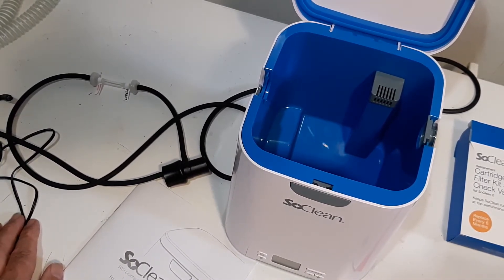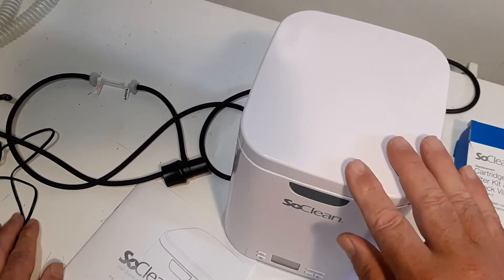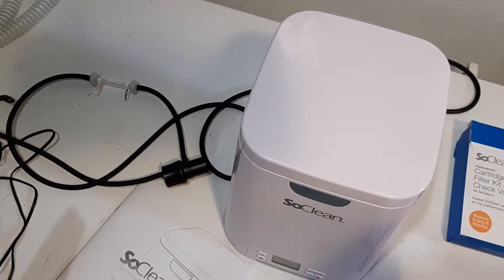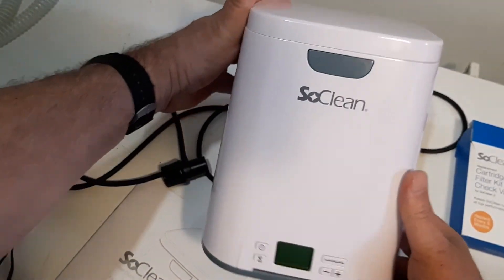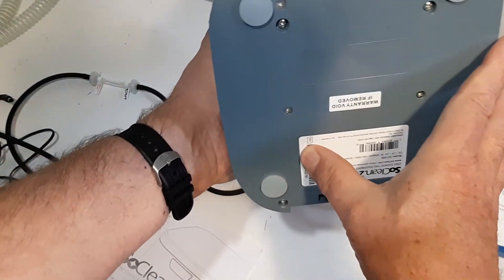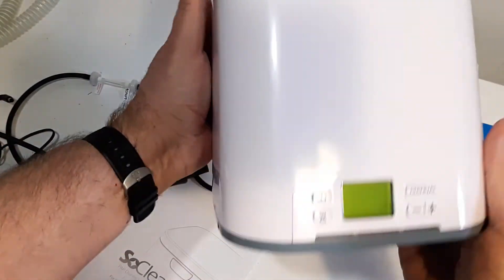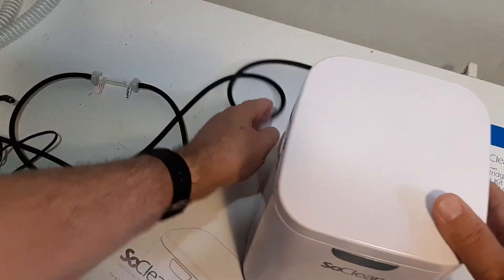Anyway, I'll get into some of the basics of the unit here. The serial number is on the outside of the original box, and it's also underneath the unit right here. You can find it on the bottom of the unit itself even if you can't find it on the outside of the box.